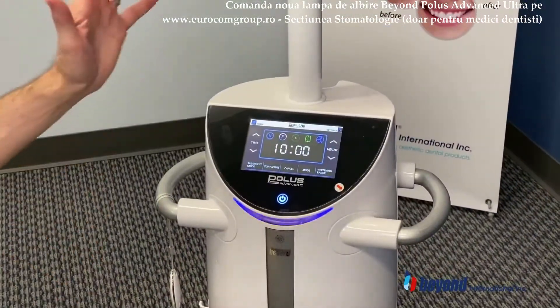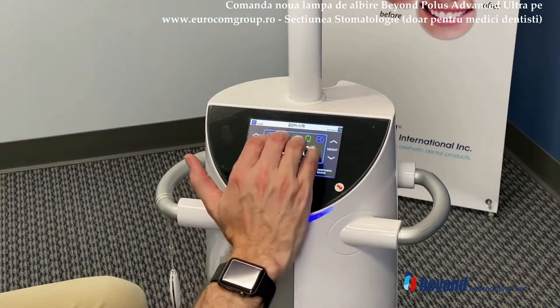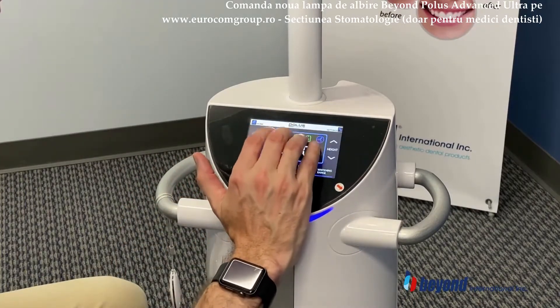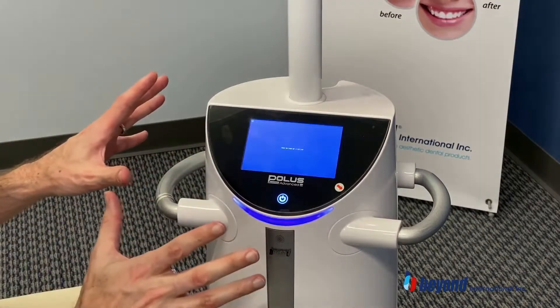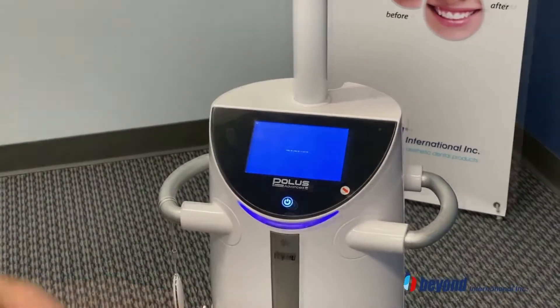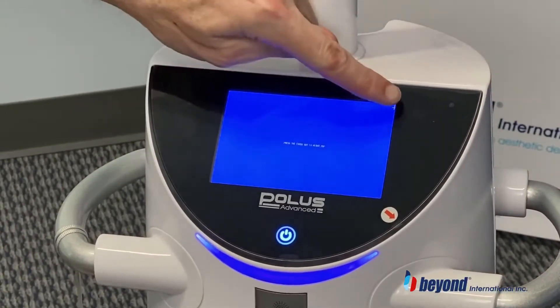If you're ever in a situation where you need to calibrate the unit, this is how you can do it. You basically want to tap onto the screen within the first box. You will hear a beep and then it's going to reset. Then you just want to gently touch each corner as the cross shows.